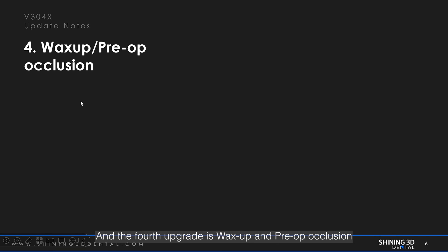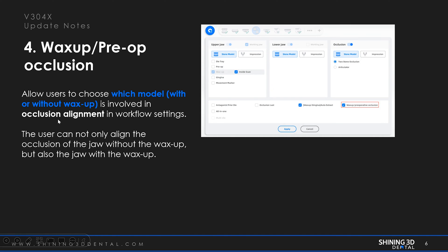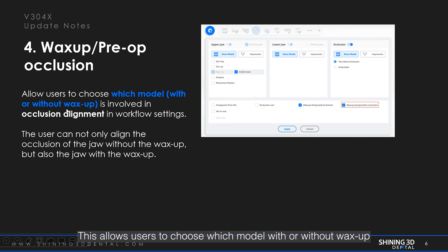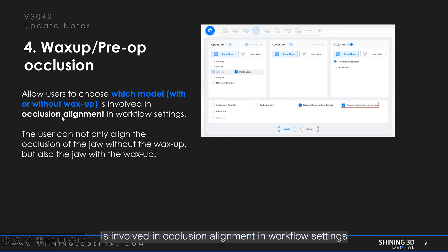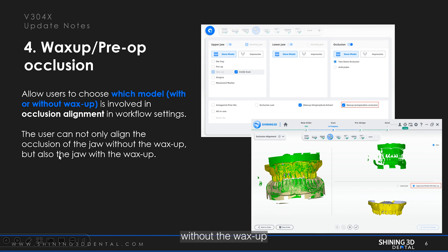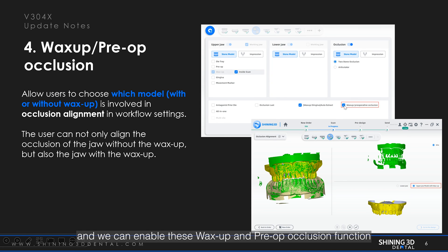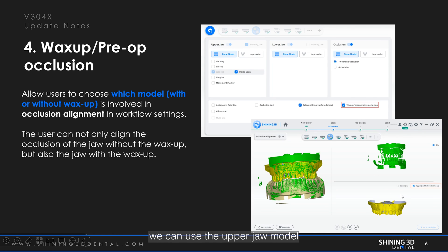The fourth upgrade is waxup and pre-op occlusion. This allows users to choose which model — with or without waxup — is involved in occlusion alignment in workflow settings. The user can align not only the occlusion of the arch without the waxup, but also with the waxup. As you can see in the workflow settings, we can enable this waxup and pre-op occlusion function. After enabling it, we can use the upper arch model with waxup for occlusion alignment.